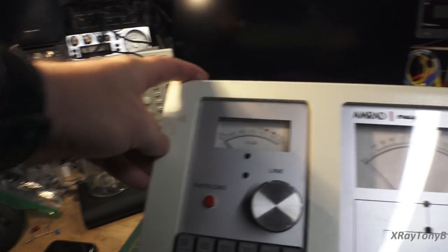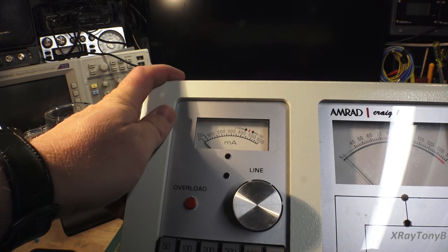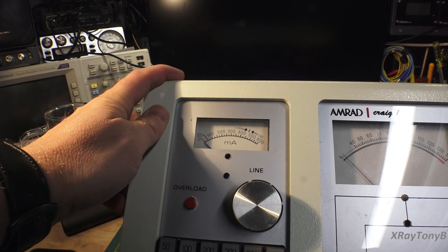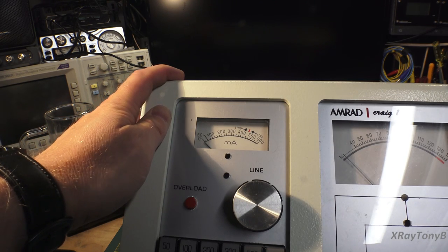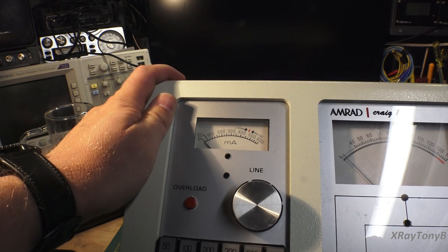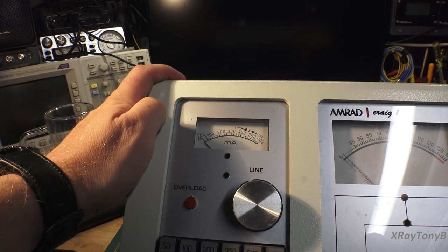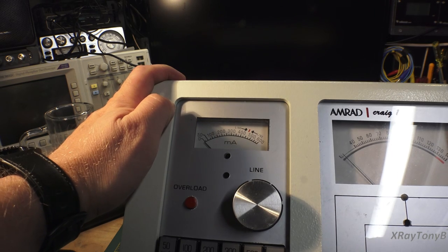I'll zoom over here. We see a meter that reads in milliamps. And in the X-ray industry, they don't say milliamperes or milliamps, they say MA. It's all like one word almost, MA. And you'll hear me a lot of times use that phrase. And that's why, because for 30 years, I referred to milliamps as MA. So, this is why.